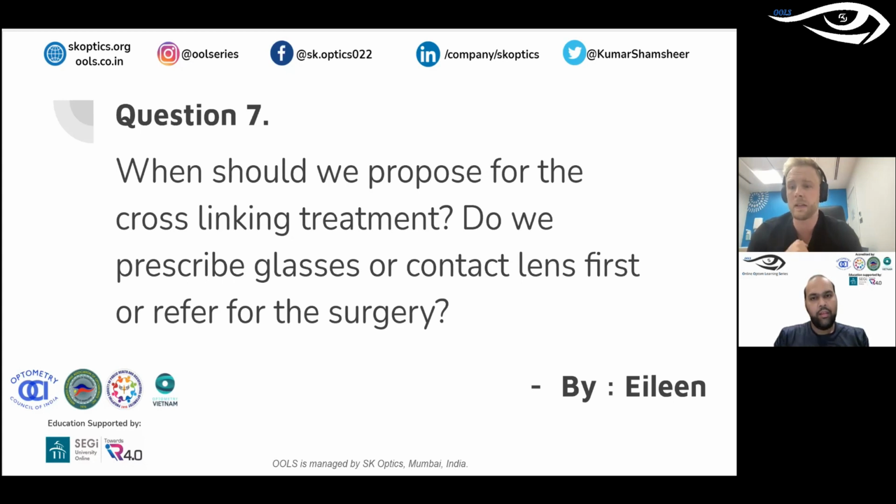Sometimes I'll take some scleral measurements and send them through for cross-linking, with the idea that by the time we get the lenses, they can come back for the initial collection pickup once the epithelium's healed. I work quite closely with a few manufacturers. So as long as I write that in the notes and it's covered under warranty, if I do need a 0.50 or a 0.75 change in refraction, that's fine. You're fitting the sclera, not the cornea, so it shouldn't change much anyway. But that's just me trying to hurry things along a little bit and kill a few birds with one stone.